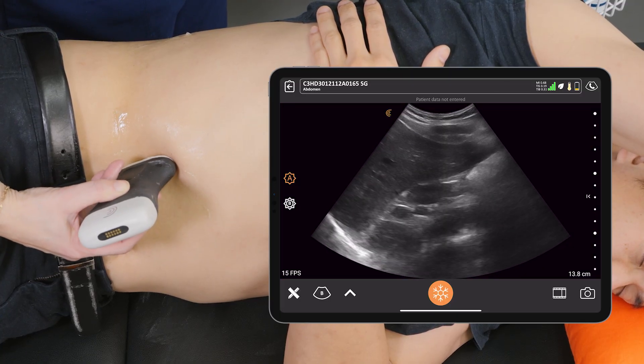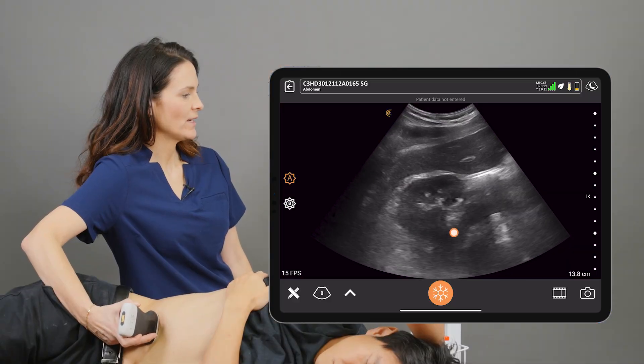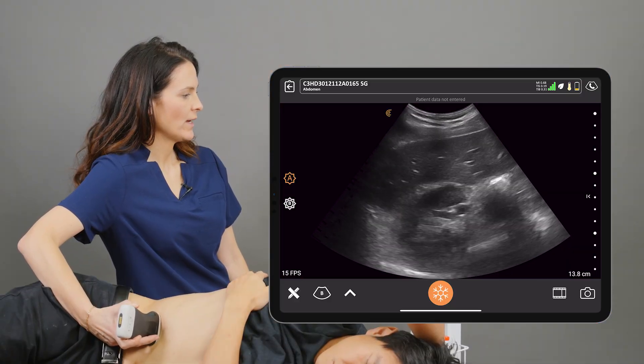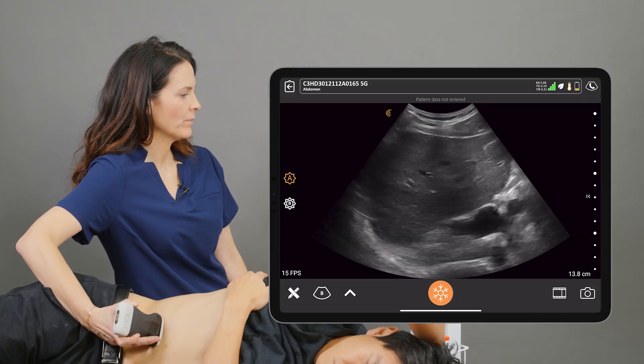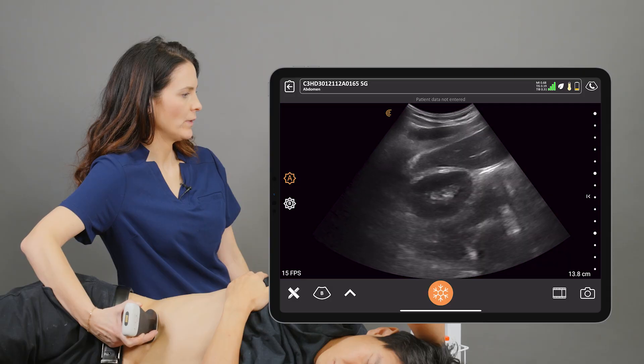If we rotate our scanner 90 degrees, we can view the kidney in a transverse orientation and we'll scan all the way to the upper pole and down to the lower pole.